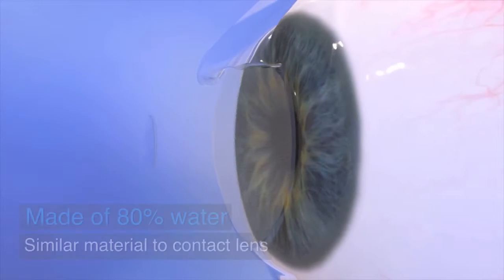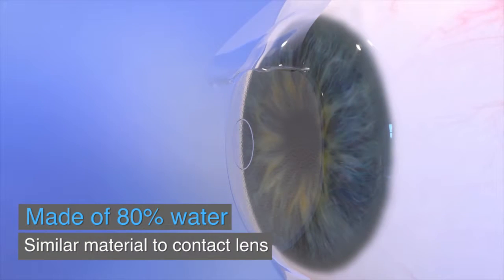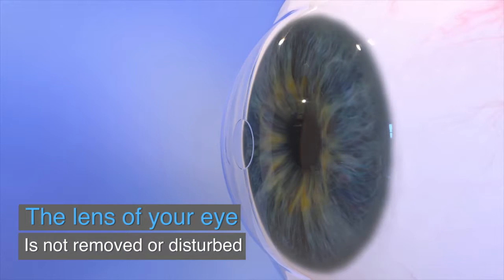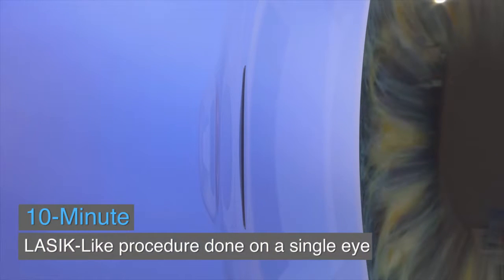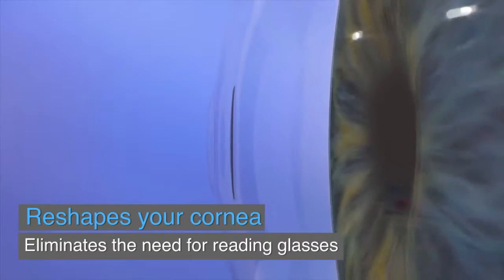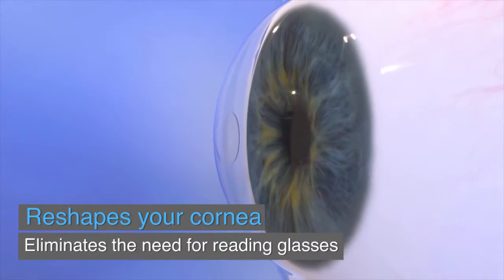Raindrop is a small transparent disc made of approximately 80% water and is similar material to a soft contact lens. Unlike other procedures to fix the need for reading glasses, Raindrop does not remove or disturb the lens of your eye. Instead, the inlay is gently placed in the first few layers of the eye in a simple, 10-minute LASIK-like procedure. The Raindrop Near Vision Inlay helps reshape the front of the eye and restores near vision, offering a long-term solution for reading glasses.